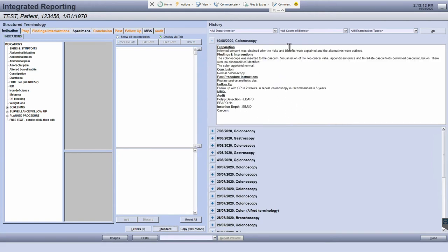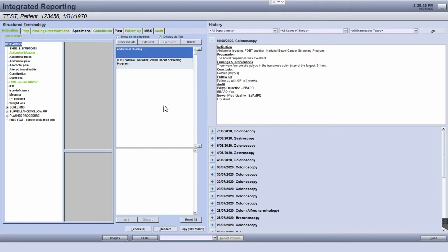You can see now that the standard report template has been applied to the report. You can also create a new standard report template if you find that the one you want to use isn't available in the list.